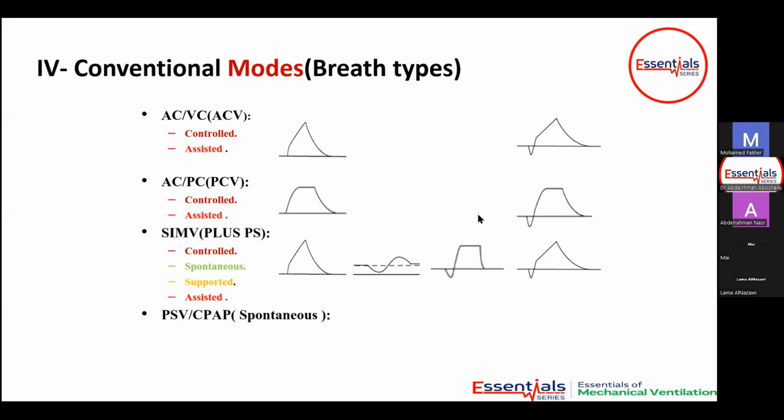What about the spontaneous mode? Spontaneous mode, CPAP or pressure support, CPAP plus pressure support, either gives a spontaneous breath when you do not apply a pressure support, or gives you a supported breath when you apply a pressure support.